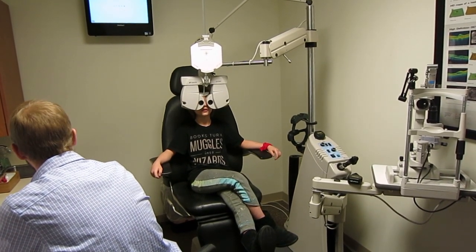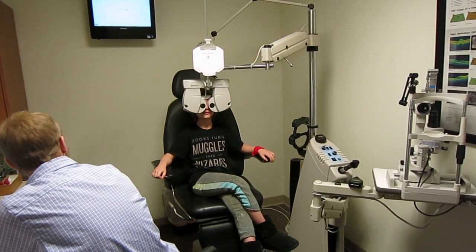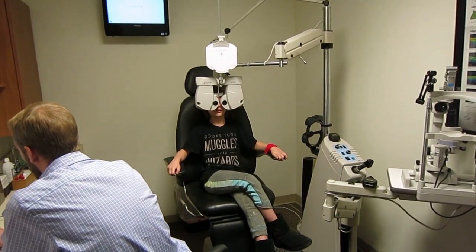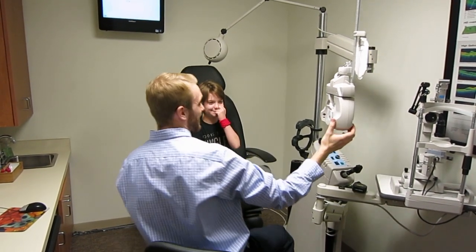How about two or three? I don't want them to get any smaller or any darker, just clearer. Three is a tiny bit clearer. Good job. And then A or B? They look roughly the same, but I think A is a little clearer. So that's with glasses. I'm going to pull it away and show you without so you can see how much these are going to help you. Really a lot better with glasses. So we just kind of did the glasses test and I actually do need glasses. On that sign there's text I couldn't read — it looked like makeup smudges — and I could do the eye tests way better with the glasses machine. It was so much better with the glasses on; I wasn't even aware that was possible to see.